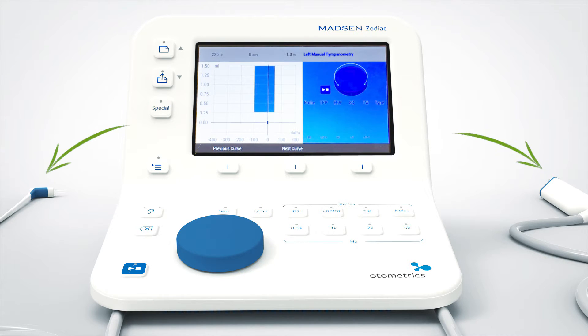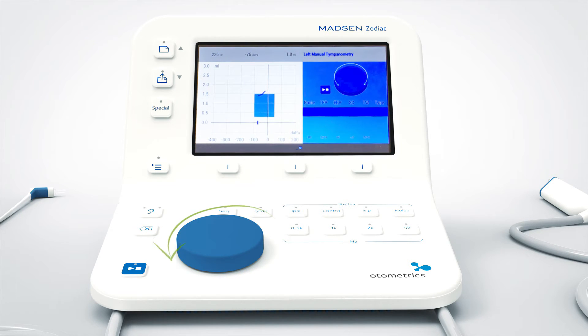Grab the probe, place it in the patient's ear, press the play button, and adjust the pressure with the wheel. My manual tympanometry is completed and ready.